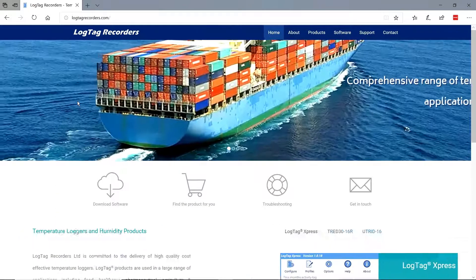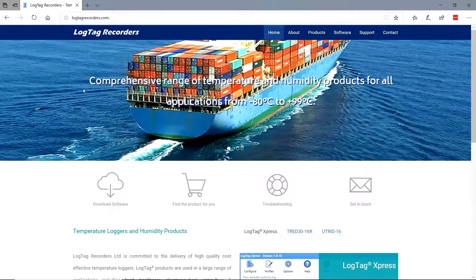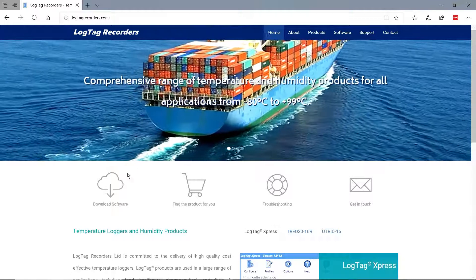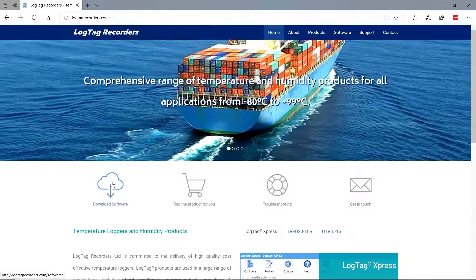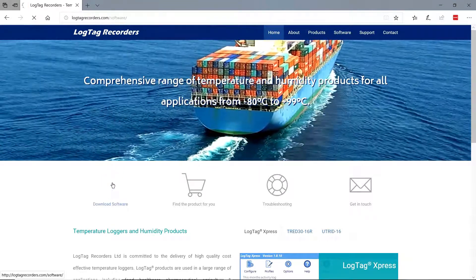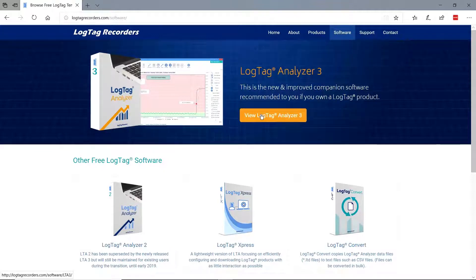On the home page, click the download software icon that is located on the left center of the web page. Next, click the button View LogTag Analyzer 3.